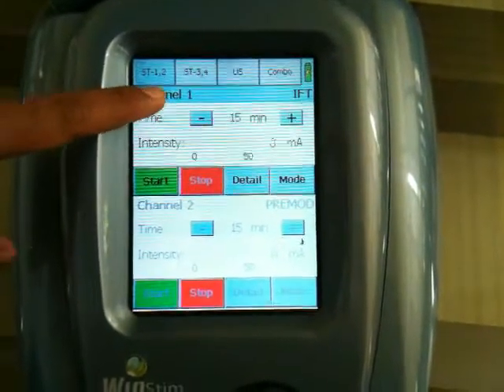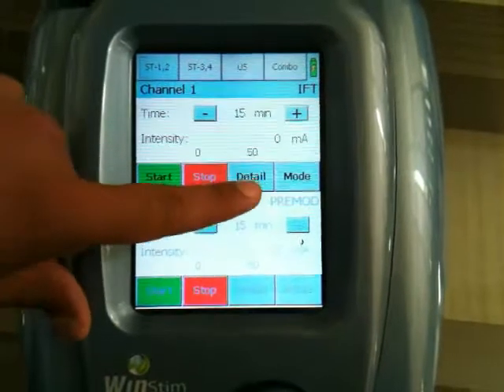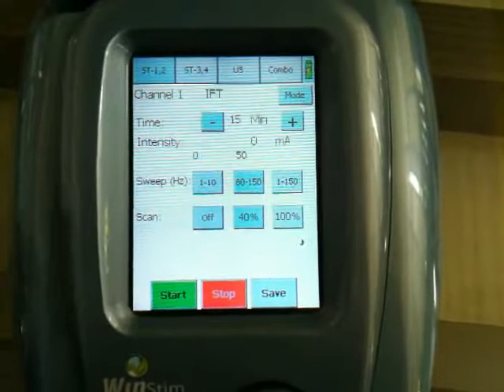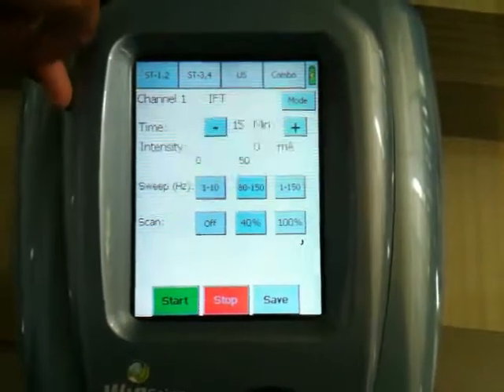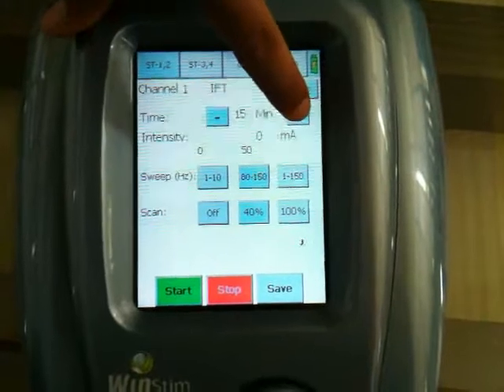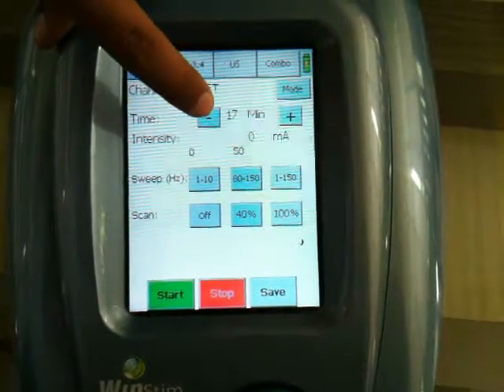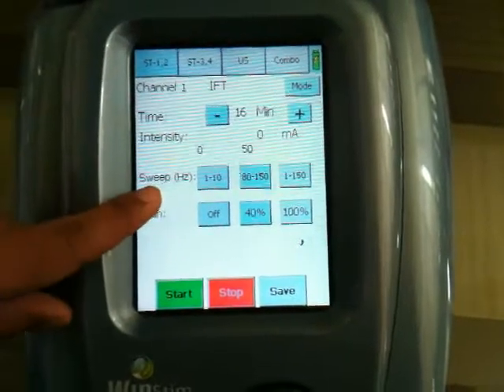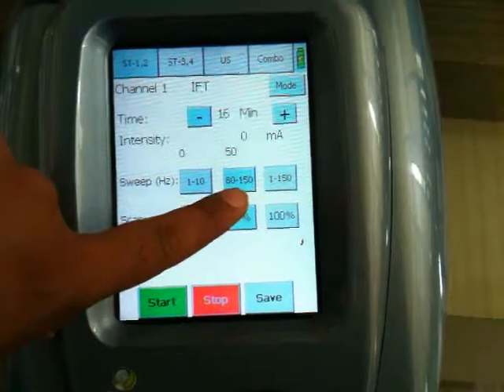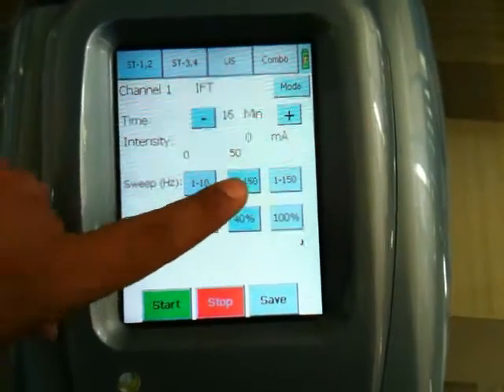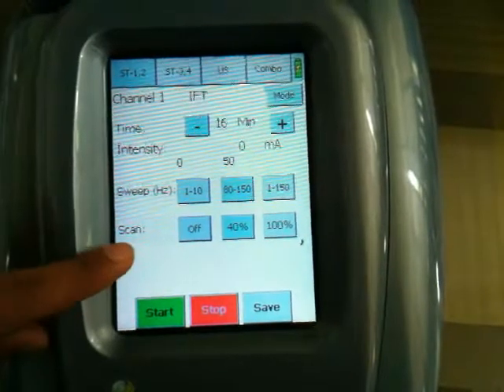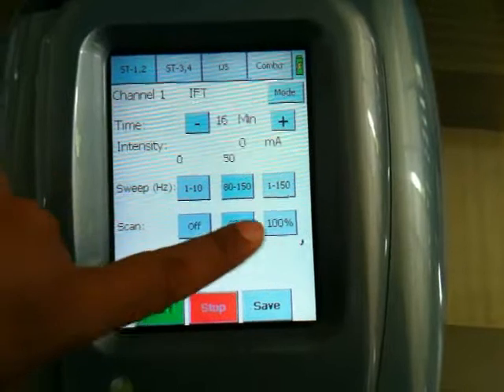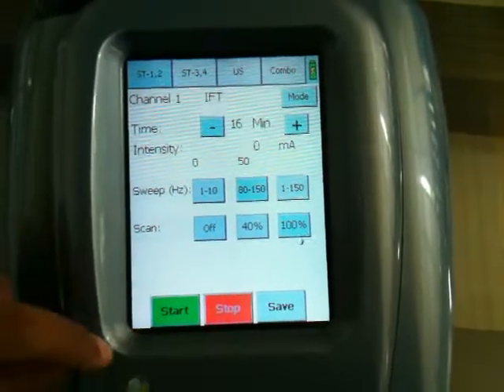By pressing on channel 1, channel 1 will be activated. Now we can go to the detail mode to customize the parameters. The plus and minus symbol will help you to increase and decrease the time in 1-minute steps. Thereafter, you can set the frequency from 1 to 10 Hz, 80 to 150 Hz, and 1 to 150 Hz. Thereafter, vector scanning — we can make it off, 40%, or 100%. If you want to change the modality, go to the mode.